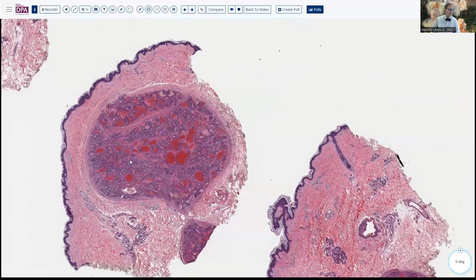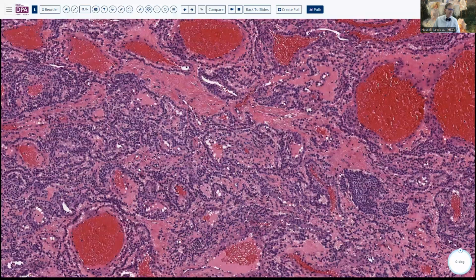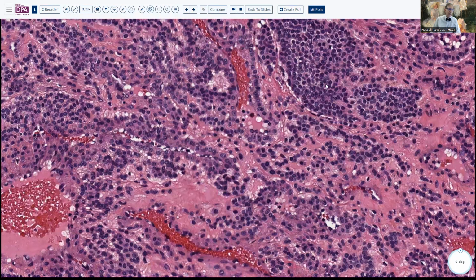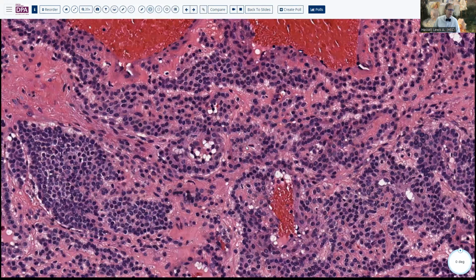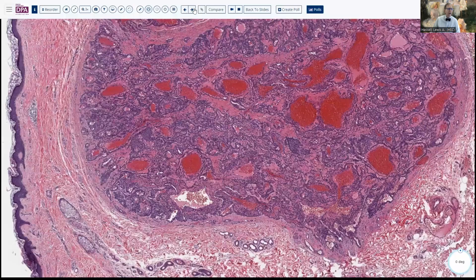This one from the skin, obviously, within the dermis. And this one's showing quite a degree of vascular ectasia, almost pseudo-angiomatous or peliosis-like appearance. But again, with these very uniform cells with nice round nuclei and no particular mitotic activity. Again, fairly sharp cell borders that I think you can see here, even in this lesion that's not very compact.